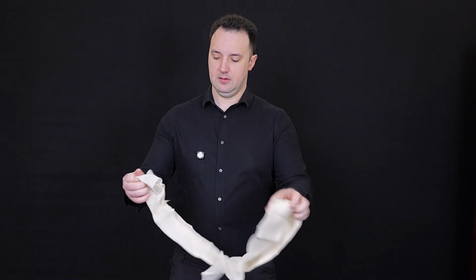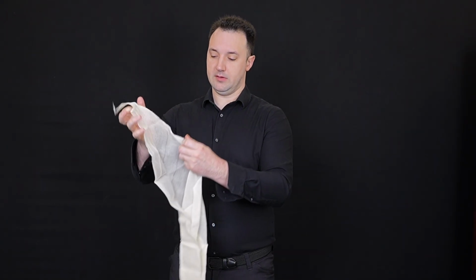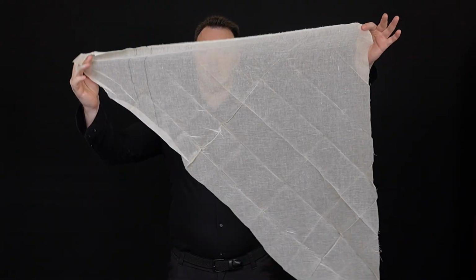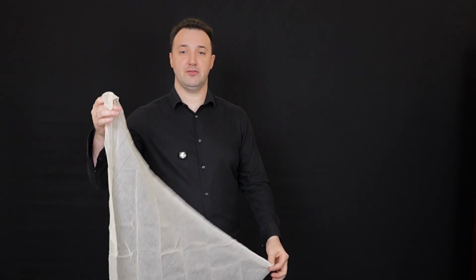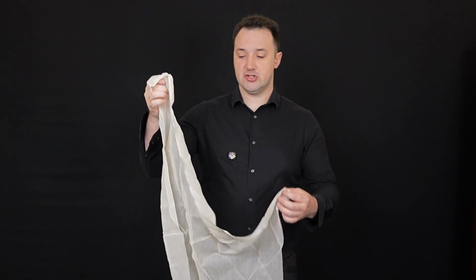Okay, so in first aid kits, you'll often have these really big triangular bandages. They call them triangular bandages because they're a giant triangle. This is a square that's been cut in half, basically. So if you ever have a really big square or a rectangle, you can get to this shape. This shape is used a lot in first aid to make slings and bandages and all sorts of stuff.